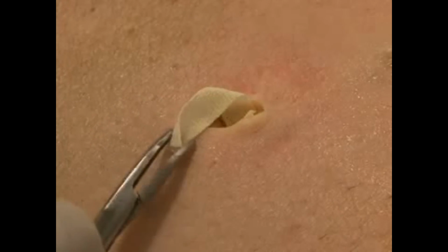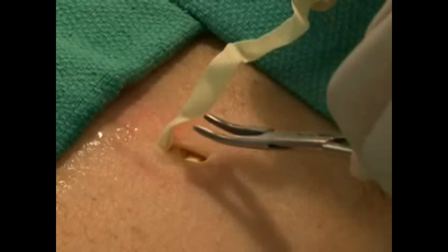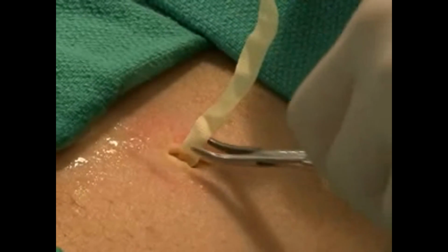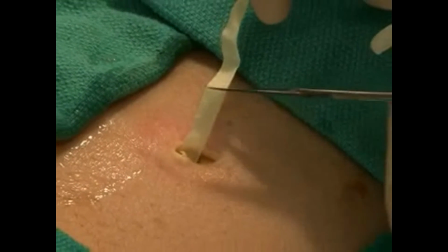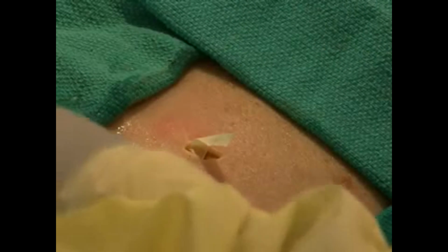On subsequent visits for wound care, packing should be removed to allow assessment of the ongoing healing by secondary intention. Use of fresh packing material may be necessary to continue the healing process if significant wound drainage is still ongoing. A follow-up visit should then be rescheduled for 2 to 3 days later. This is common for abscesses that required extensive drainage. In the absence of other complications, the need for repacking is not an indication for antibiotic treatment.